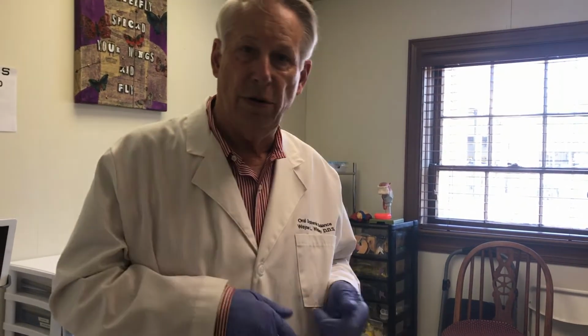You can still do blood pressure and pulse, because when you're affecting the blood pressure, usually, or the pulse, it's the pulse that usually is the most predominant one. Then oxygen goes up and high pulse rates go down. The reason the pulse is up is because there's a lot of adrenaline in there trying to get the blood around faster and faster and faster. It doesn't have a whole lot of oxygen in it. So if they're down around 93, 94, usually the pulse is way up. And sometimes it's the blood pressure that's way up.